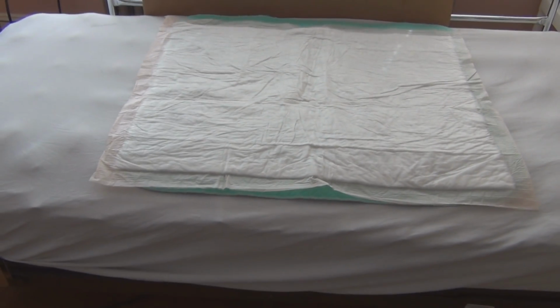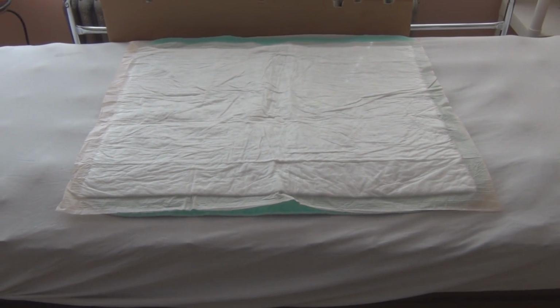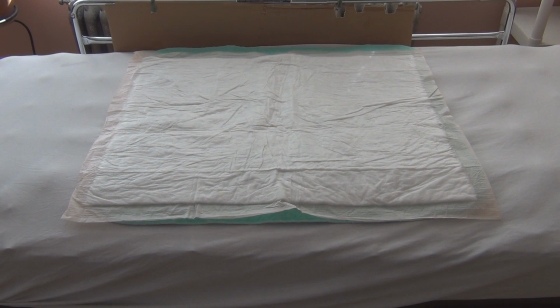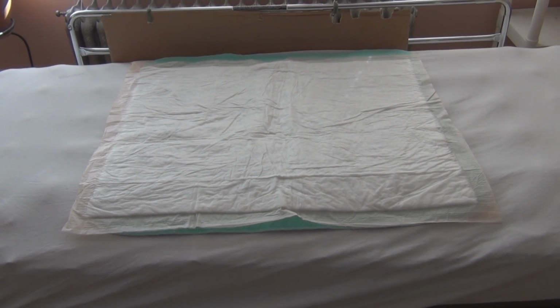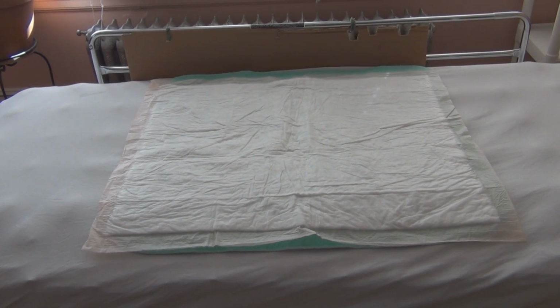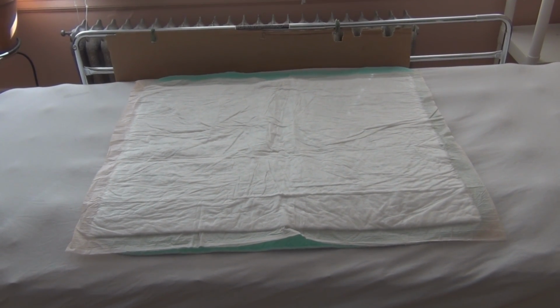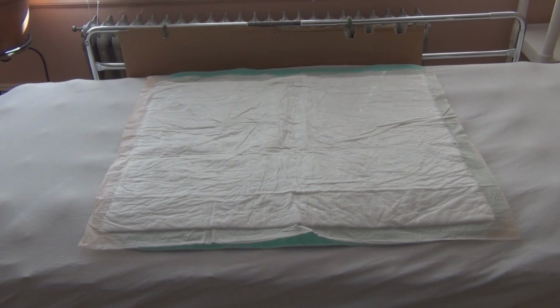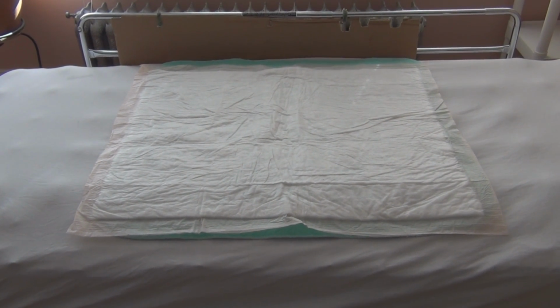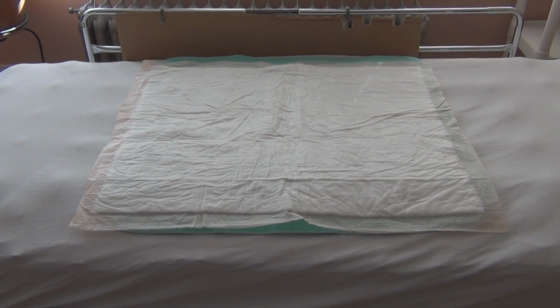So that's the alternating pressure mattress with the pump, really necessary for people who spend a considerable amount of time in bed. Even with that, you're supposed to prop pillows under them, alternating the hips, so they're not laying in one position more than 20 minutes, which is a lot of work, and a lot of times the individual doesn't like to do that either, depending on their disability. So this really is a necessary piece of equipment to start off with, the alternating pressure mattress.